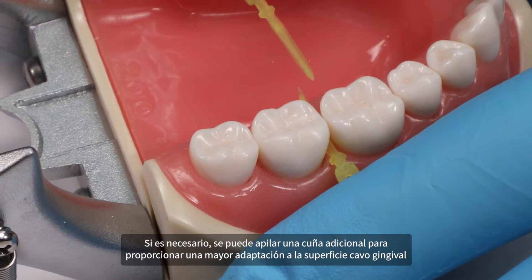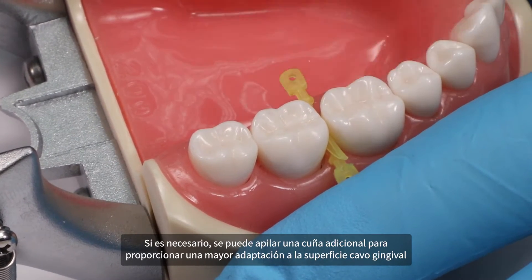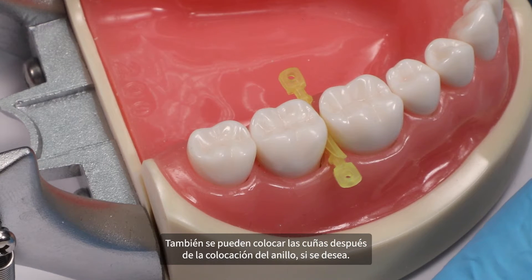If needed, an additional wedge may be stacked to provide greater adaptation to the gingival cervical surface. Wedges can also be placed after ring placement if desired.